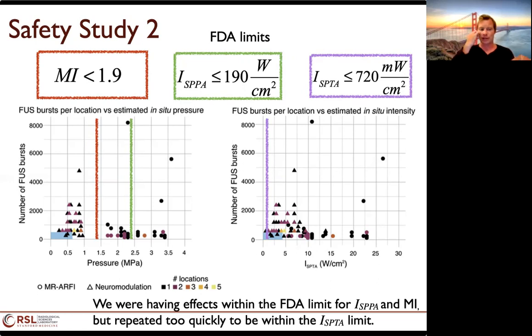And Kim, just to confirm, even though they were separate studies, when you said neuromodulation here, you used the same visually evoked potentials metric for all of those points? Yep. Okay. Yep.